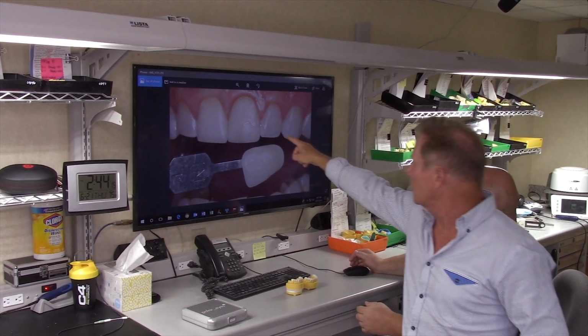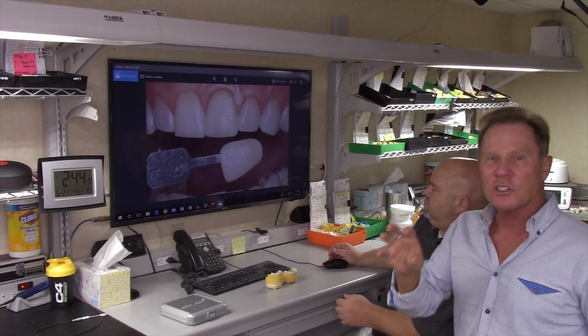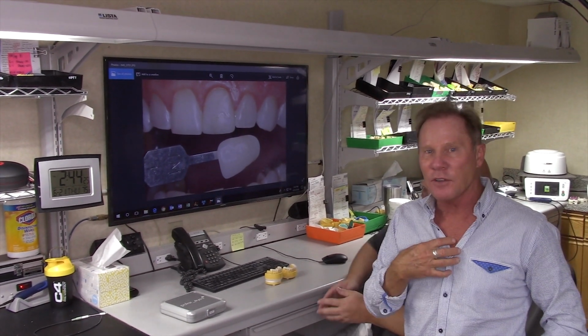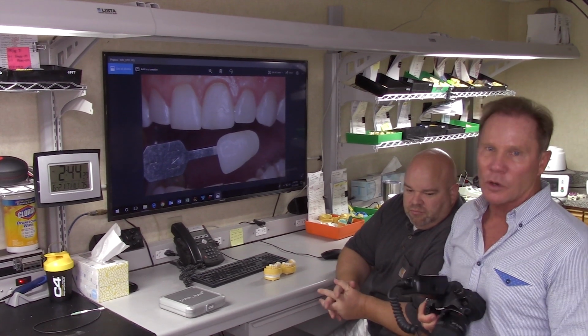Now, as I mentioned earlier, you can see some shininess off the reflective surface, which hides some of the information that Phil will use for that final restoration. One tool that I found invaluable in my practice, especially matching existing teeth, is what we call a polarizer.